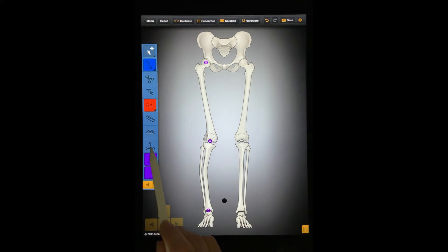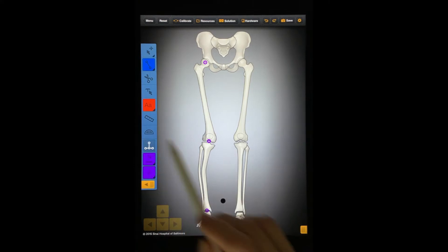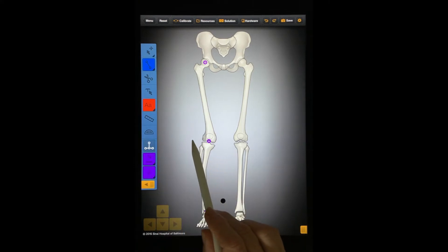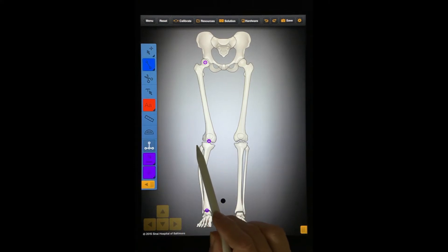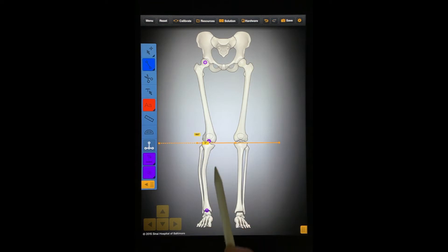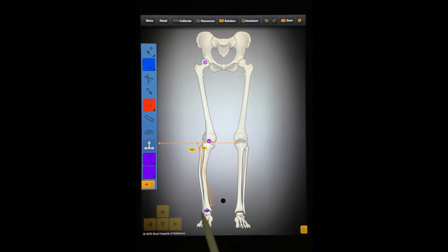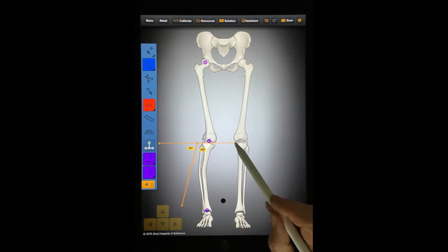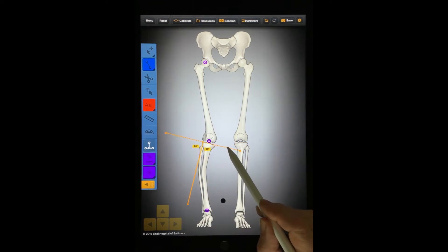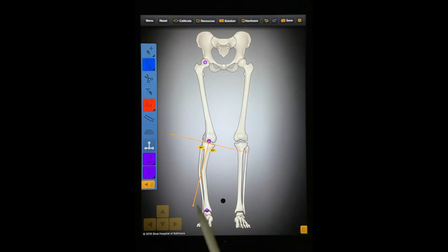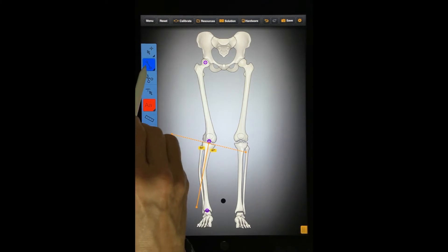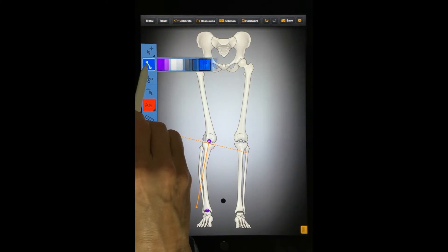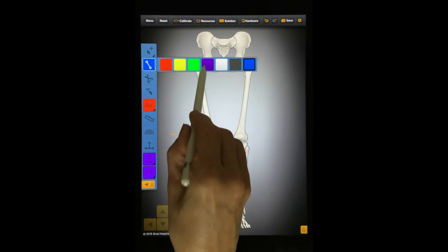Let's look at the Angle Template tool. The Angle Template tool allows you to insert an adjustable angle template. Draw a mid-diaphysial line of the distal tibia.